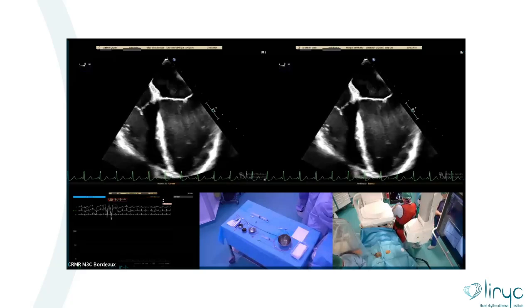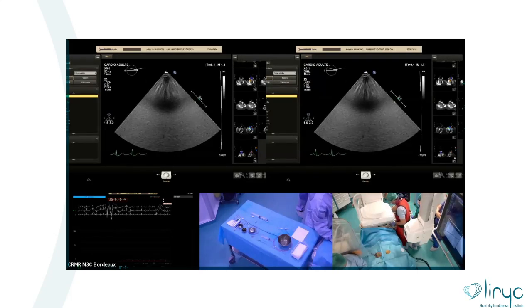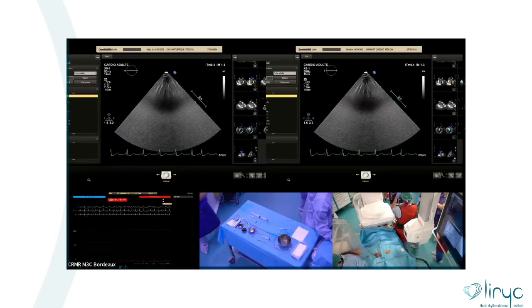So Dr. Pan is with us because he has big experience of closing this kind of shunt under echo guidance. So we will try to close this one under his supervision, only on the echo guidance, TE or we will see. Okay, can I let you introduce the case, the technical issue?